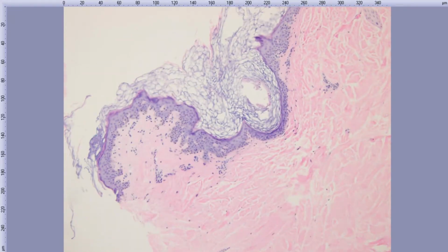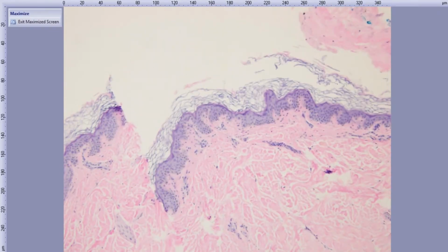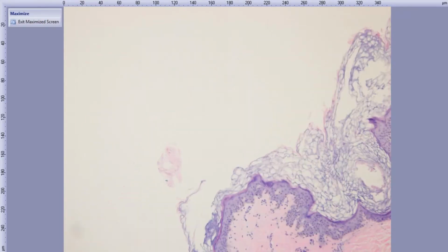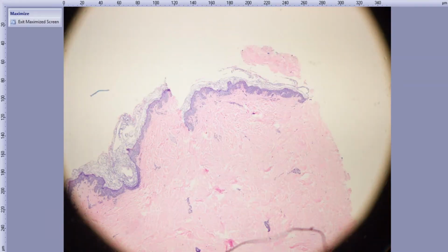You see that epidermal nevus we just saw? You see how it kind of is papillomatous? Just slightly right here as well. It's just kind of subtle. And so this is a somewhat similar differential to the one we just saw, but just less pronounced. And for this person, we had a history submitted as brown velvety patches that were kind of reticulated on the chest and the back. So this one is actually confluent and reticulated papillomatosis.